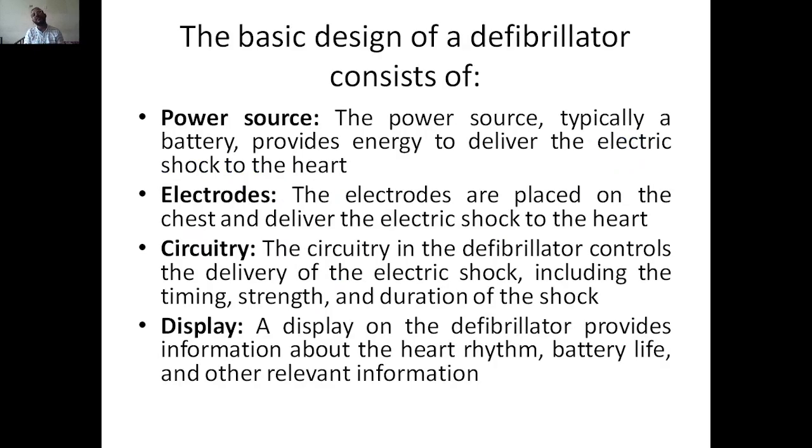So the basic design of a defibrillator. Usually, what does it consist of? It consists of a power source. When you want to give the electric shock, you need to have a power source.